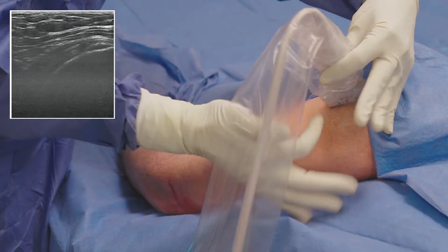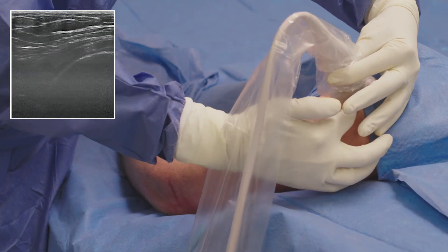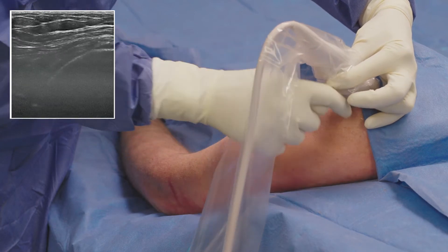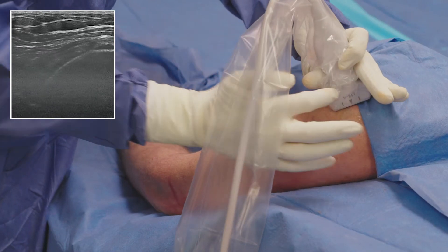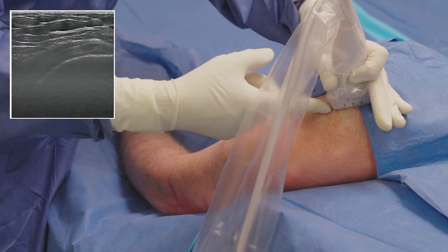With ultrasound, I scan the tendon in an axial and longitudinal view to identify and confirm the location of the pathology. On ultrasound, we can see the supraspinatus where there is some hypoechoic tissue that we will target with TenJet.